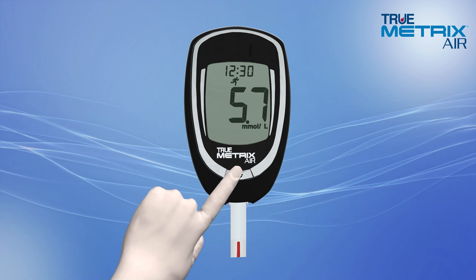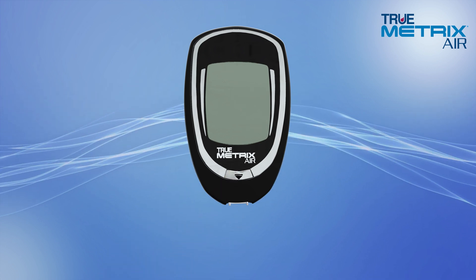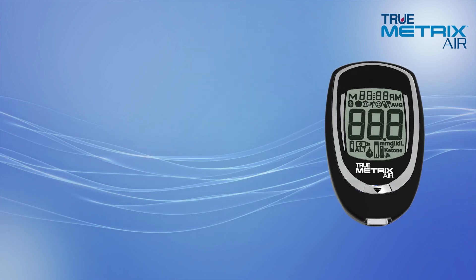Afterwards, hold your meter with the test strip pointing down and press the strip release button to discard the test strip. The meter automatically turns off. That is it. You have just completed a blood glucose test.